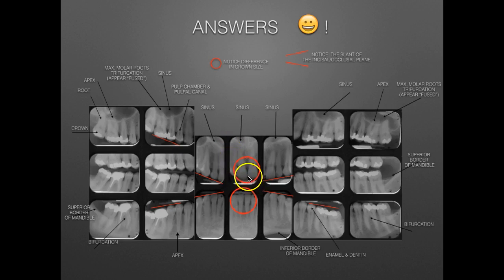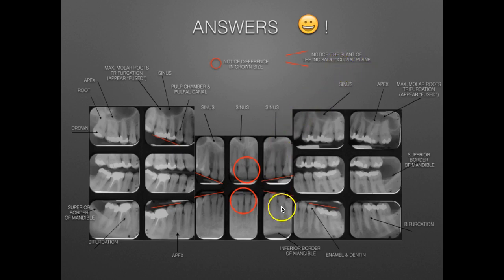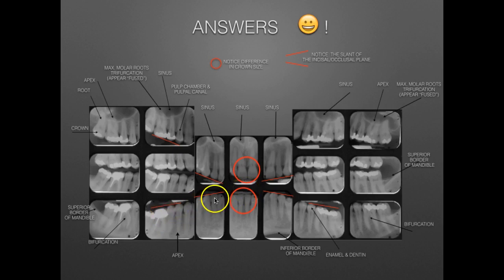Something else to notice is the difference in crown size. Based on dental anatomy, the crowns of the maxillary central incisors are much bigger than the crowns of the mandibular central incisors. Also notice the incisal or occlusal plane — for the mandibular teeth in radiographic images, the occlusal plane tends to slope upward toward the midline. For the maxillary dental arch, the occlusal plane tends to slope downward from the posterior to the anterior midline.